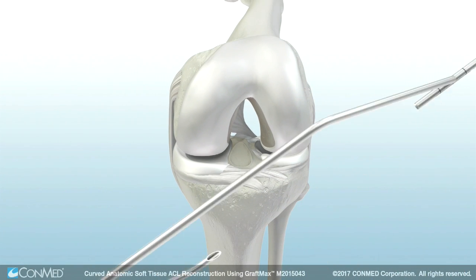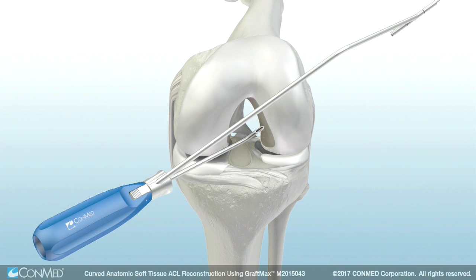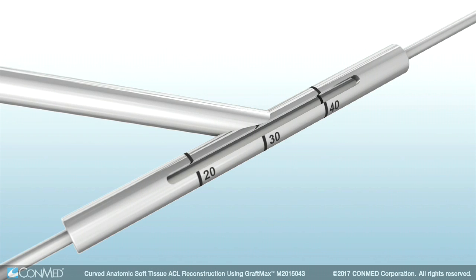Insert the GraftMax curved guide into the anteromedial portal with the knee flexed at 90 degrees. Insert the GraftMax indicator pin into the sleeve and down to bone to assess the projected guide pin exit and femoral aperture to cortex, or AC, length.